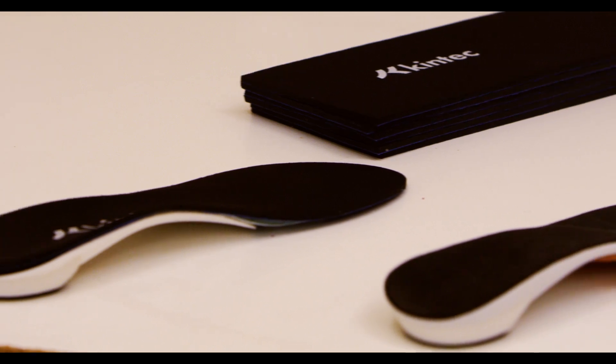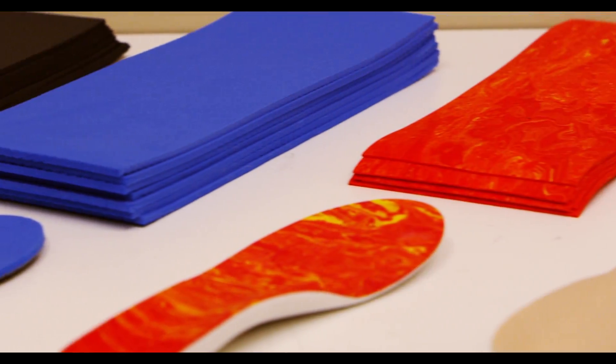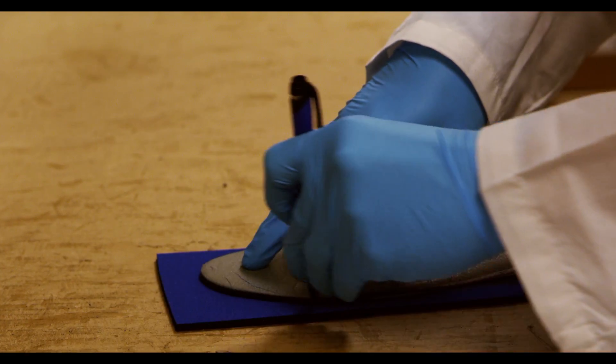The last step in producing your custom orthotic is to apply a comfortable top cover. This top layer gives the foot a comfortable surface and protects the different components of the orthotic. Once the top cover is glued in place, it is trimmed to your shoe size.